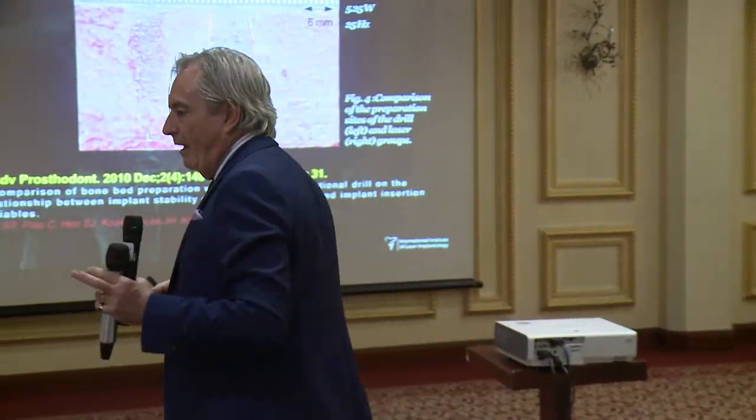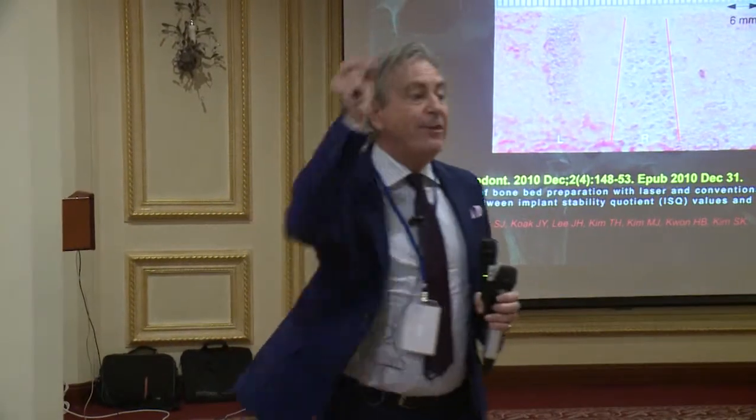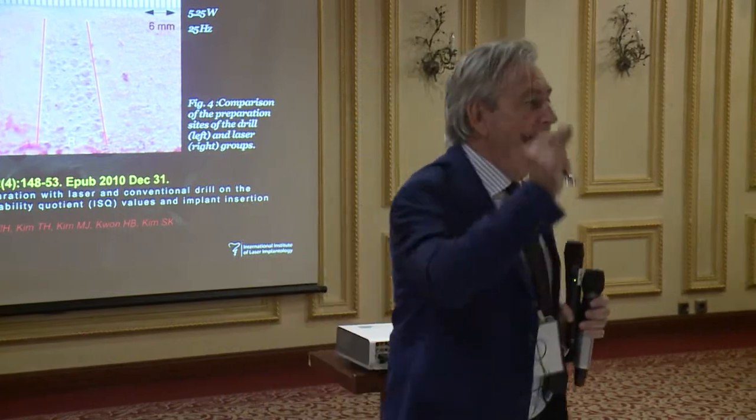For those that are expert in endodontics, you have probably heard about these germs. What are they? The germs that are stuck inside the tubules. Some of them go more than 1 millimeter, more than 1,000 microns. But if you're using a rotary instrument, you close the possibility of reaching them.